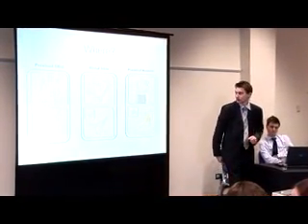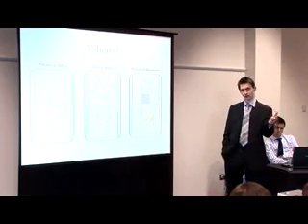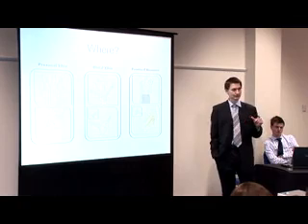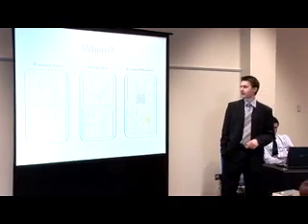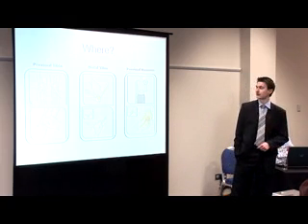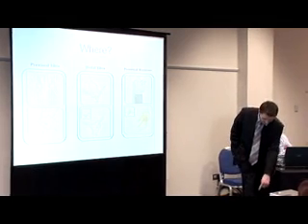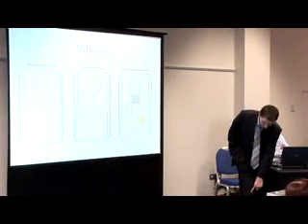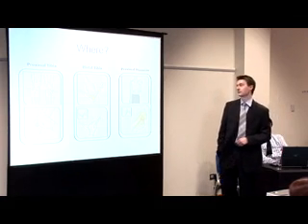In adults, put it in at that location or 1 centimeter more proximal. In kids, we go a little bit more distal, so 1 to 2 centimeters further down. The reason for that is to keep away from the epiphysis, which is the growth plate, so you don't want to go injuring the growth of their bone in future. So tibial prominence, tibial tuberosity, go more medially, flat part of bone, put it right in there.